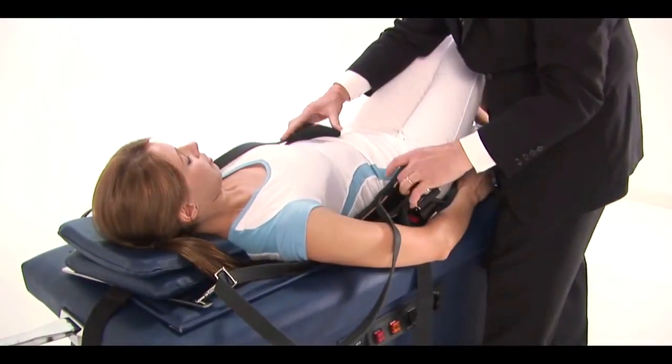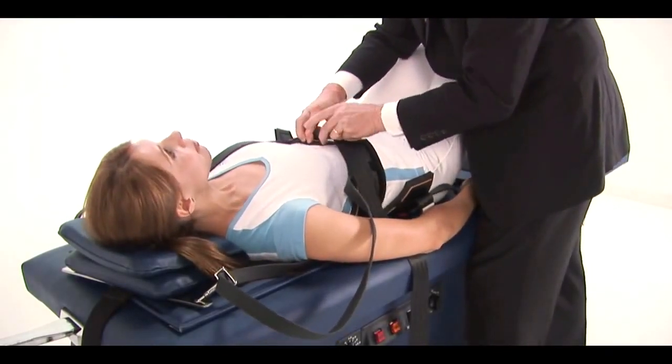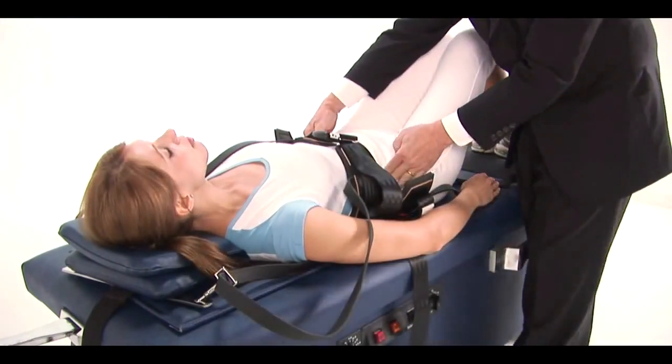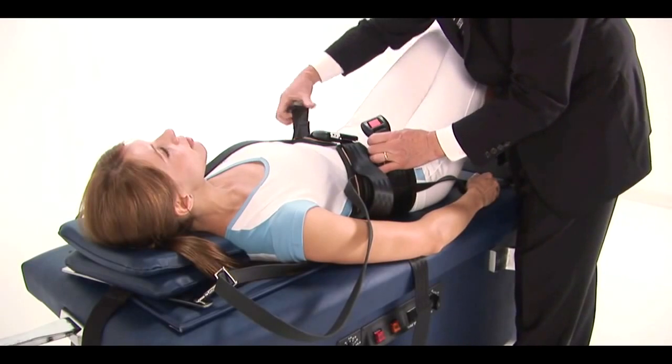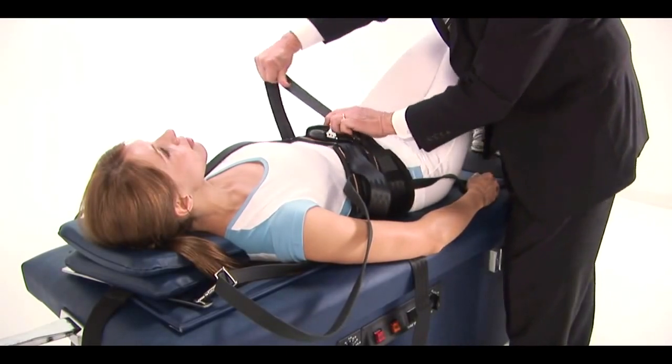Put the patient's arms through the loops and buckle the thoracic belt just below the rib cage. It should be snug but not tight. Fasten the iliac harness just above the crest of the ilium. Often this harness will overlap the thoracic harness and should be fastened quite firmly.